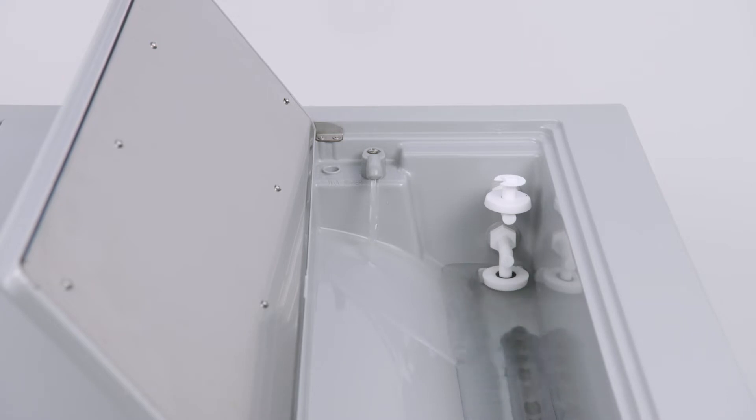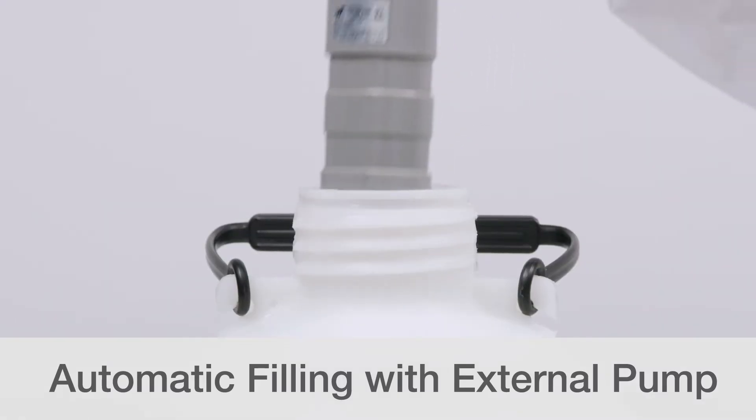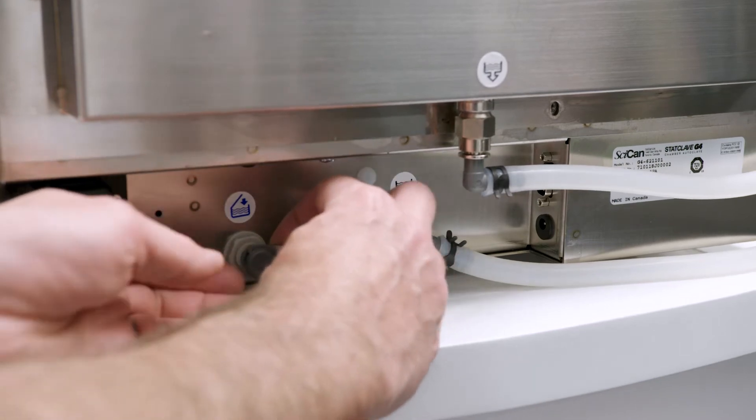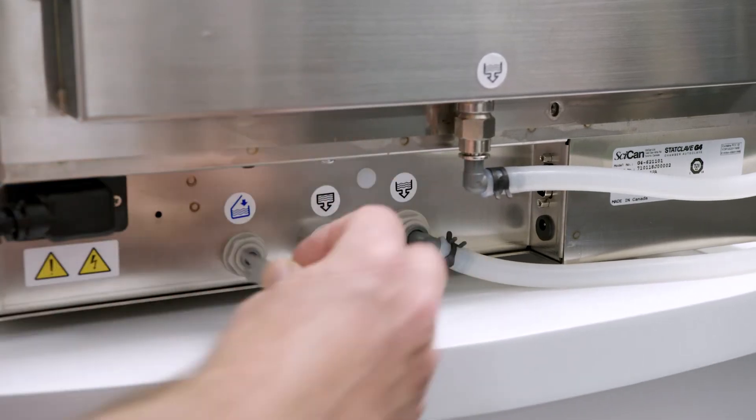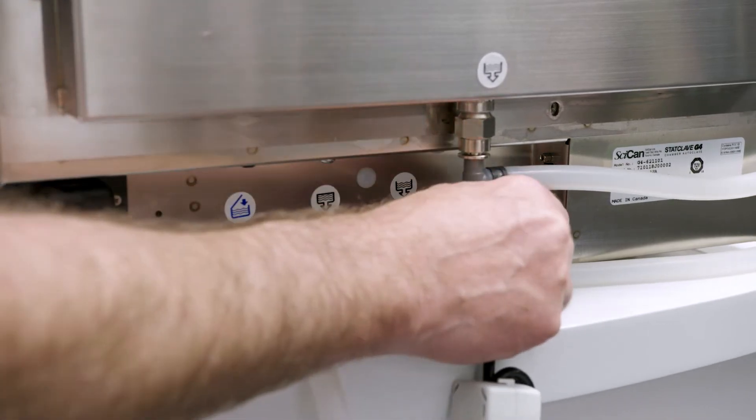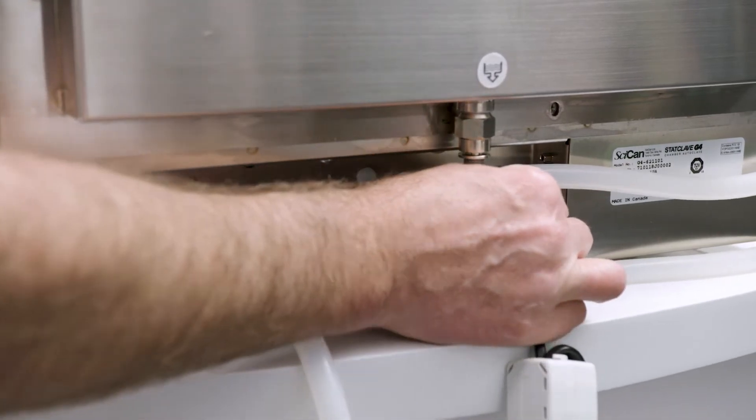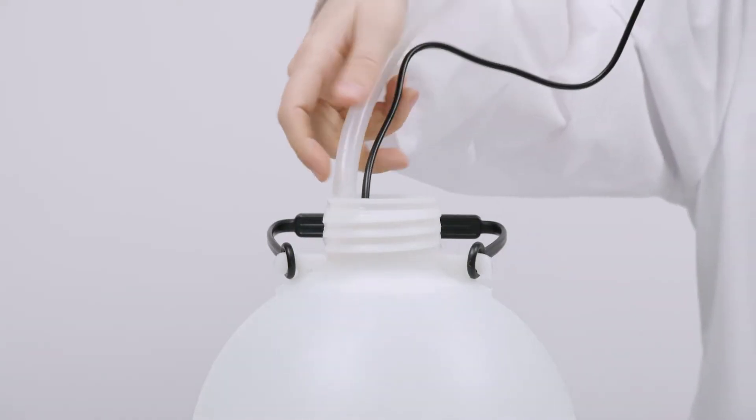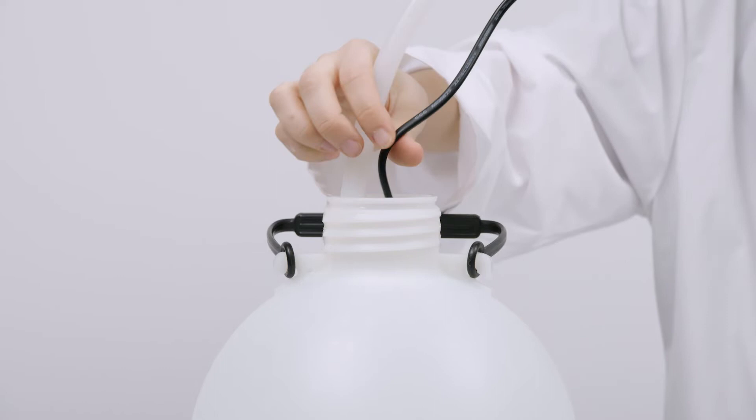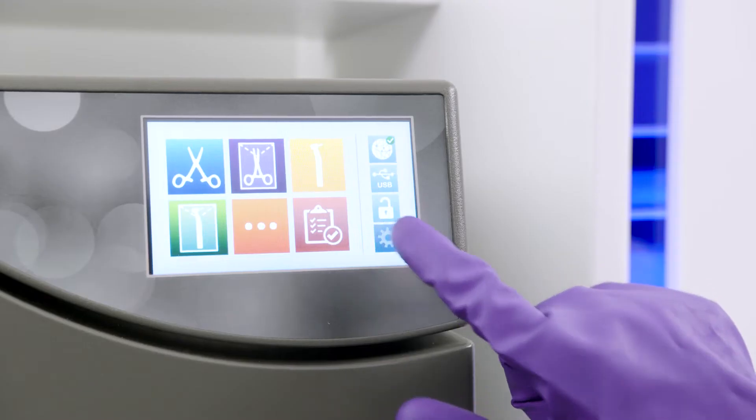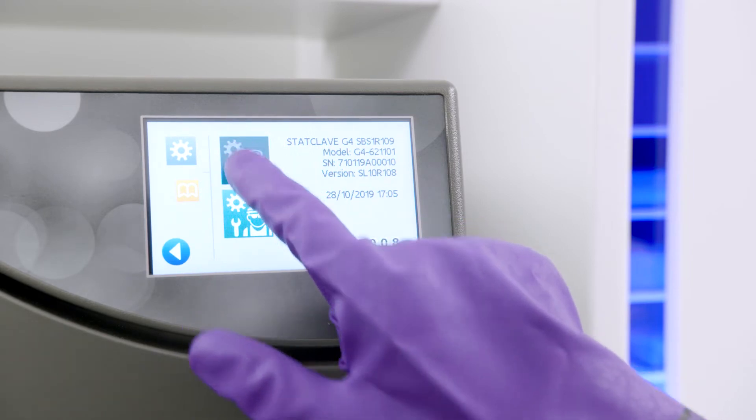You can also automatically fill the clean water reservoir using an external water tank and the optional auxiliary pump. Remove the plug from the automatic fill port at the back of the unit. Connect the fitting at the end of the pump's tubing to the port. Connect the automatic fill pump's power source to the power connection at the back of the unit. Fill the external tank with distilled water and place the submersible automatic fill pump in the external tank. And set your unit's filling mode to automatic.